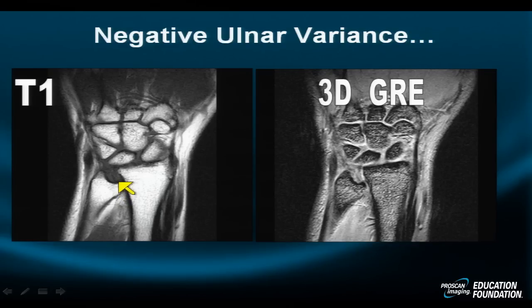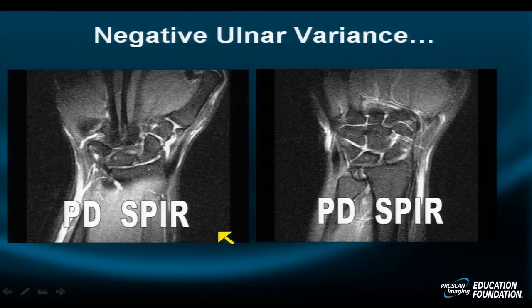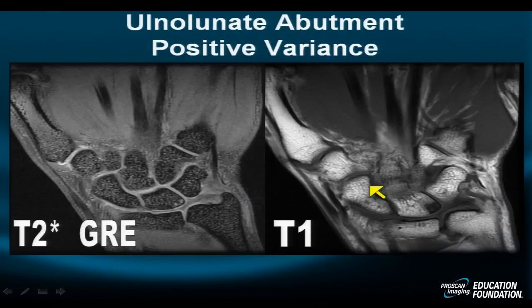Here is an example of negative ulnar variance posture. The non-styloidal ulna is more than a centimeter proximal to the non-styloidal radius. It has produced inflammation on the water-emphasized 3D gradient echo image and is starting to erode and aggravate the radius — a simple and early example of ulnar-radial abutment syndrome due to severe negative ulnar variance. This demonstrates inflammation and fluid in the distal radio-ulnar joint as a manifestation of abnormal friction in pronation and supination.